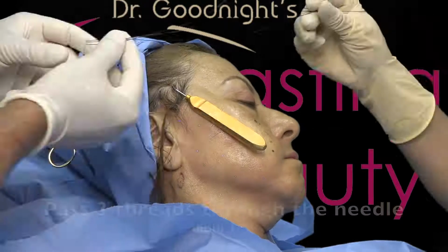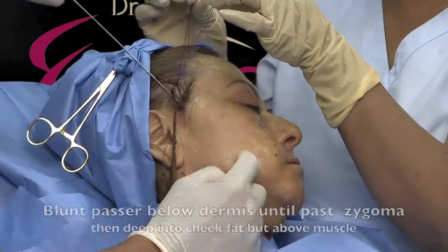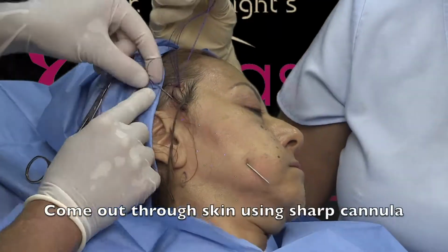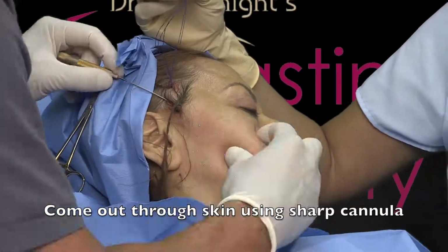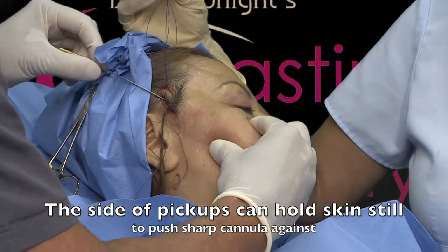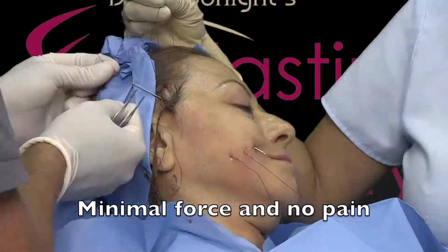You then make a 1.5 millimeter punch, and then you put this curved needle passer. You put the 3 threads through there, and then you use this blunt passer. You go in deep when you're in the face part, and then you allow the sharp cannula to come out the skin. You're repeating this basically 3 times for the jowls, another 3 times for the nasolabial folds.